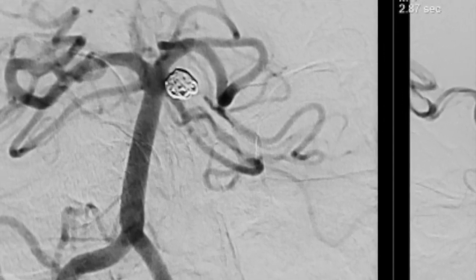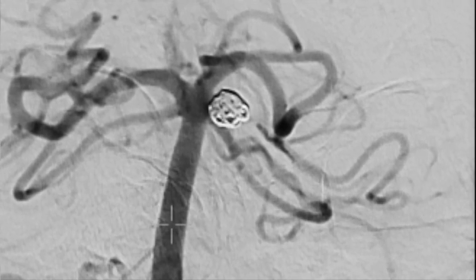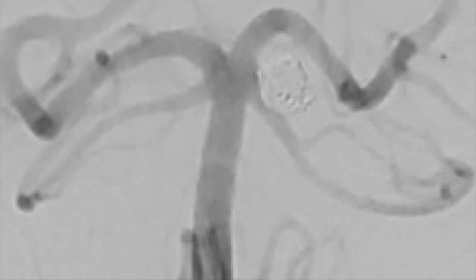And here you can see our final product shows that the coils are all inside the aneurysm. You can't see the aneurysm filling at all anymore. And this is the 6-month follow-up. Her cranial neuropathy is completely resolved. She's doing great, and this is an awesome case, and just happy to share it with you.